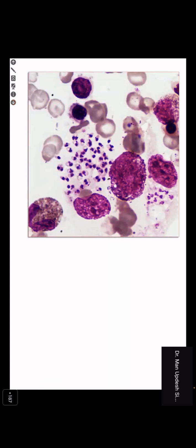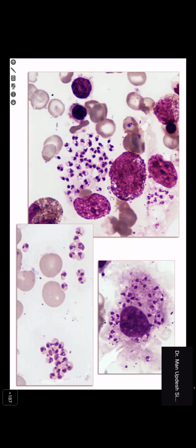So that is one. Anybody, which is this organism? May not be related to immunosuppression state. Sorry? LD bodies, right? So you see the double dot appearance with a kinetoplast. A very close differential is histoplasma, which does not have a double dot. Similar size, intracellular organism again. So if you have a double dot, it is an LD body. So cytopenias in case of leishmania, the most common cause.